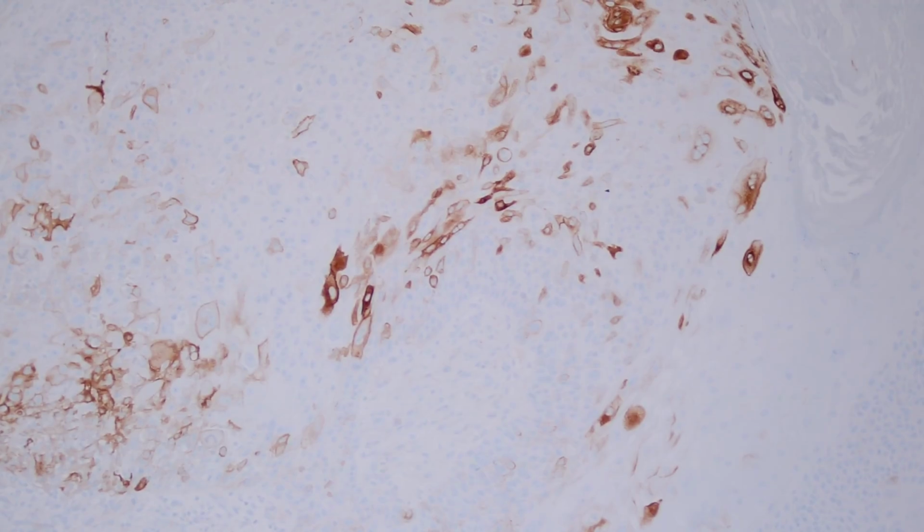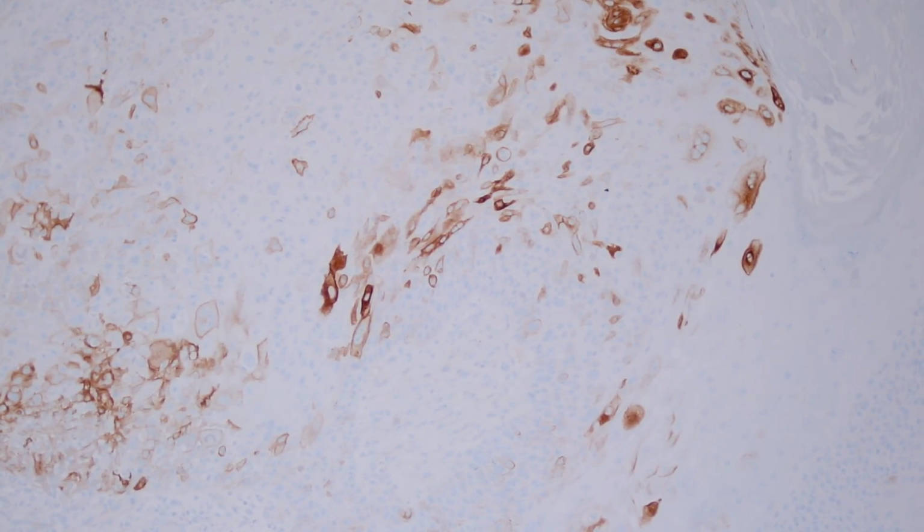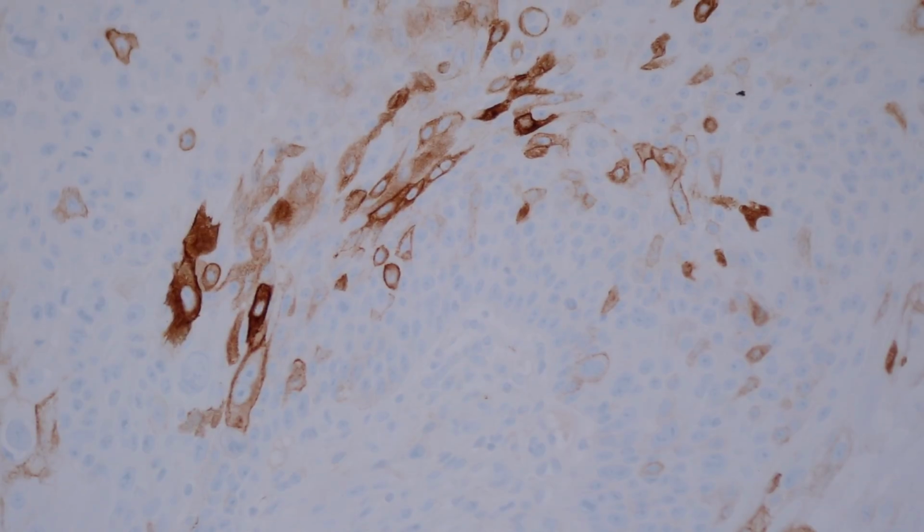So this was the squamous cell carcinoma I showed in part 1 of the immunostains video series, and you can see that this squame is actually picking up some EMA. So if you wonder, sometimes we use EMA as one of our different markers to help us tell if something's a sebaceous carcinoma or a squamous cell carcinoma, and none of those markers are totally perfect.